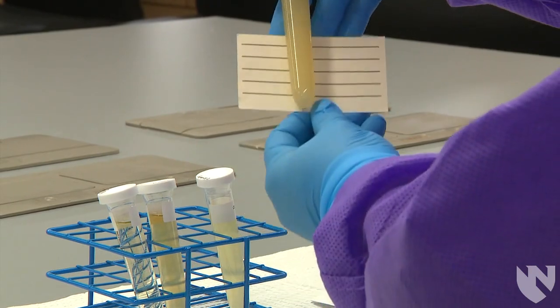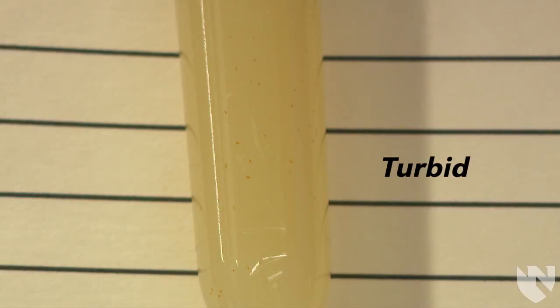Last, we have a turbid urine. When a urine is turbid, you cannot see the lines on the card at all. You will also see large dense particles or sediment falling out of solution. You may even notice thick viscous mucus in the urine.